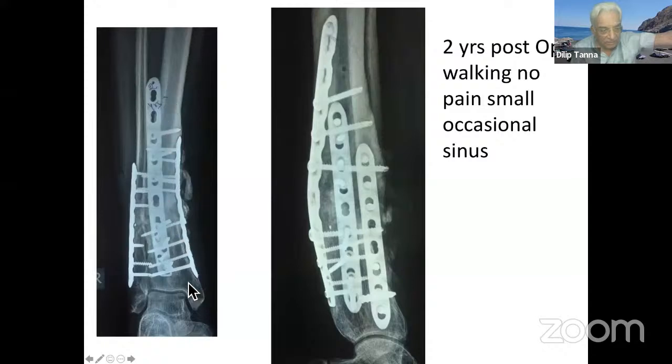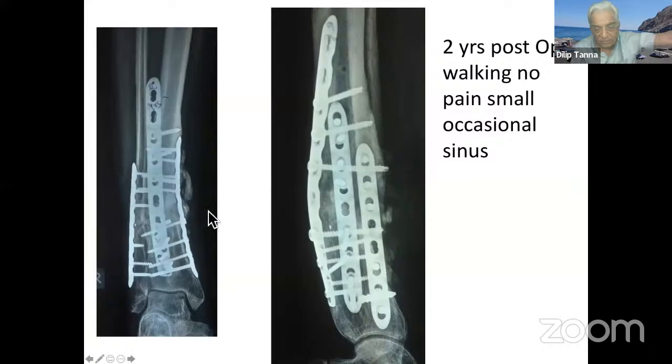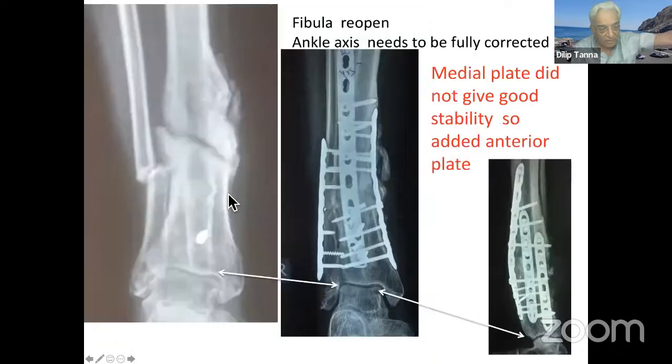This axis, I wasn't sure whether this is inherent or whatever it is, because if you go back here, there was some curvature here, but at the end of the situation, this is how it was. 2 years post-op, walking, no pain, small occasional sinus. So this is what it ultimately came to.